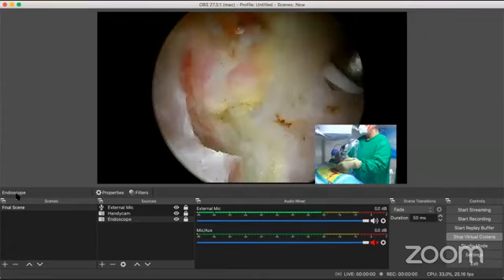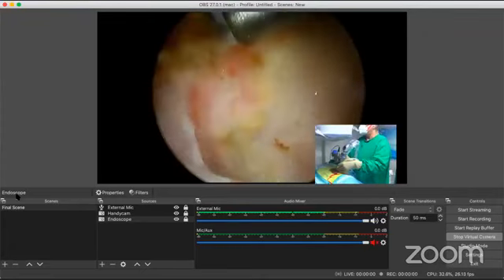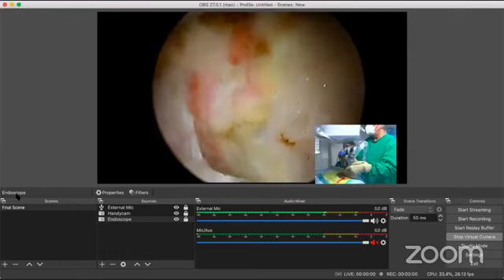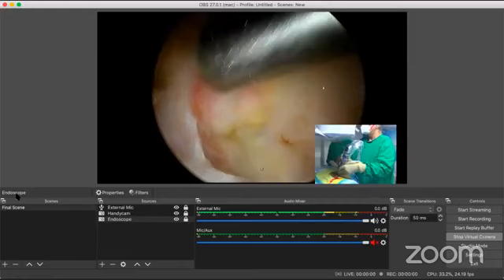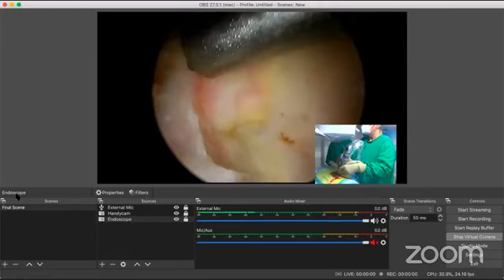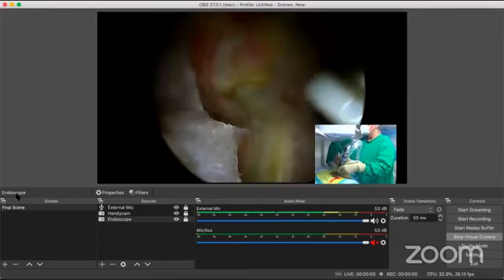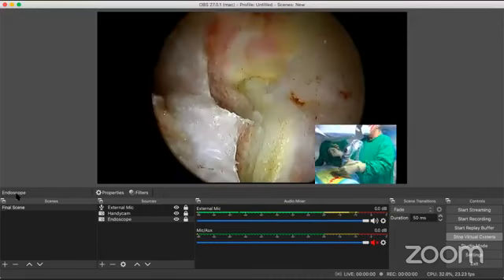Okay, guys. So I hope I'm making myself nice and clear to you during this surgery. And you can see it's so bloodless. It's so efficiently being done. Okay. Thank you. Thank you so much. Now we'll again go back to our little burring.